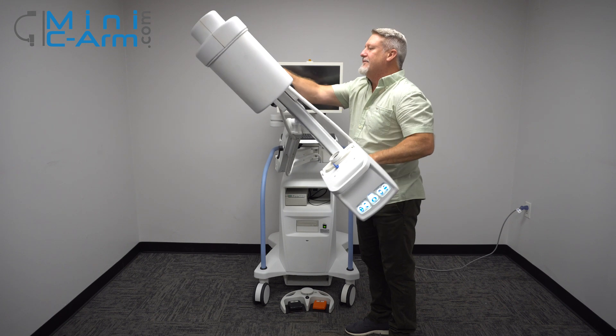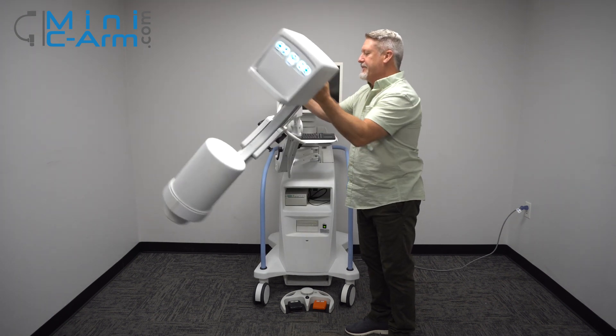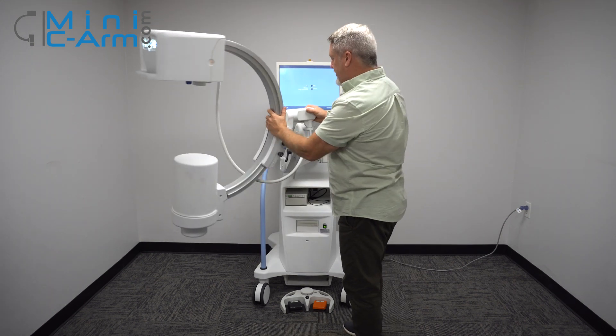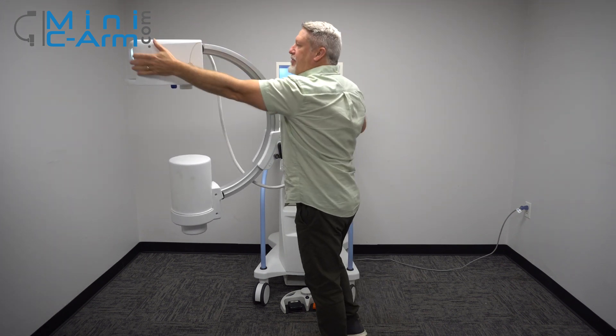We can rotate it here and back around the other way. And our orbital rotation, which is pretty nice, is about 120 degrees.